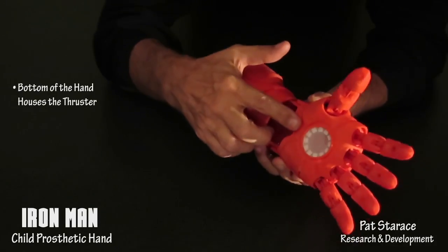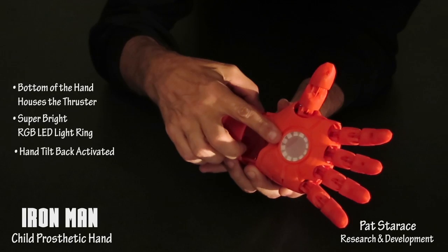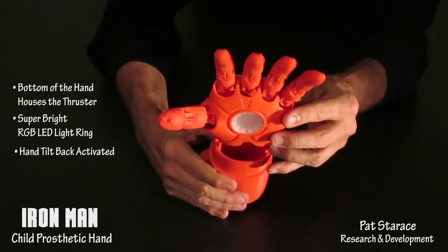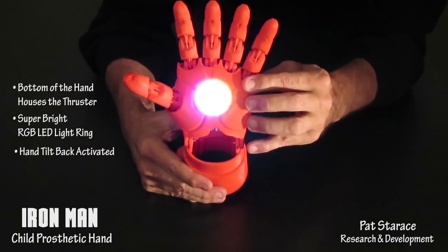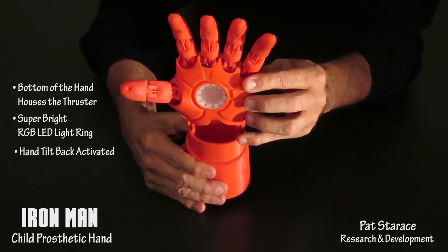The bottom of the hand houses the thruster, and it's activated by tilting the hand back. Jarvis, thrusters on. Thrusters off.